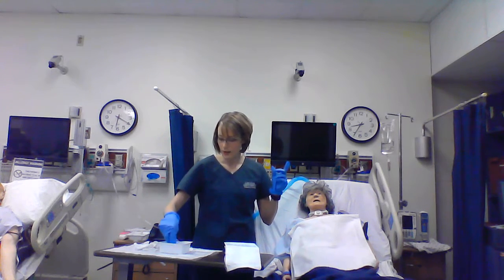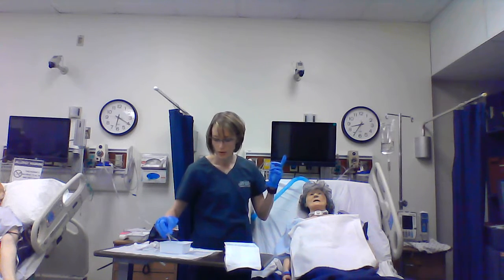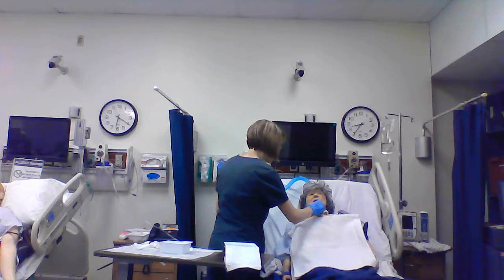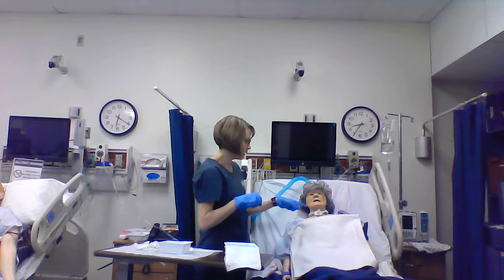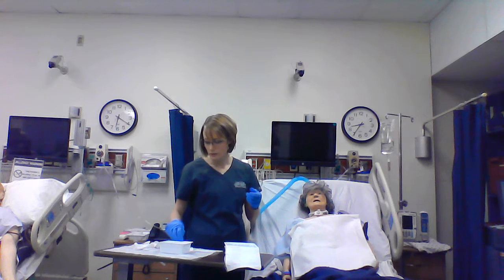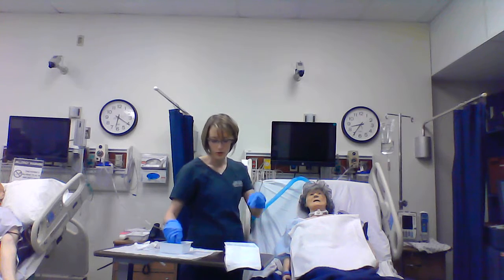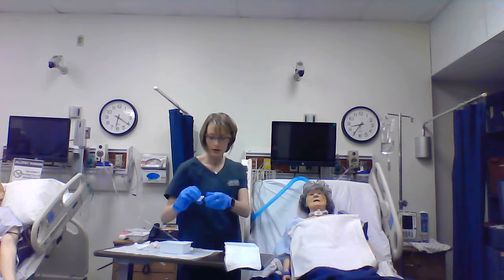And then I want to grab that with my sterile hand, the one that's not contaminated. Tap off your excess water, and then place that back into your patient's tracheostomy until you hear the click, just like that. And then you want to go ahead and clean around the stomal site and this flange if it needs to be cleaned. Do that with normal saline, unless for some reason she has crusty, hard secretions, and then you can use the hydrogen peroxide to loosen those up and get those off. So I'm going to wring out the excess saline here.